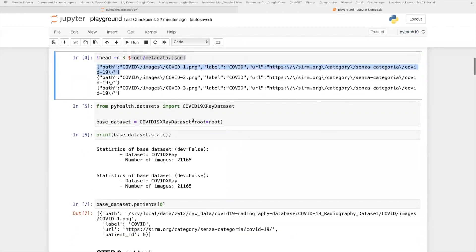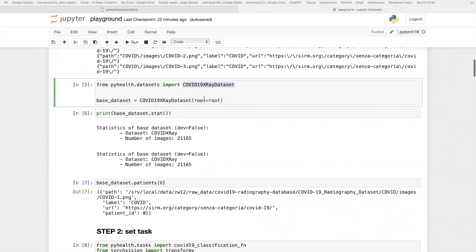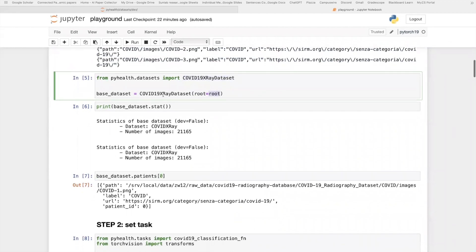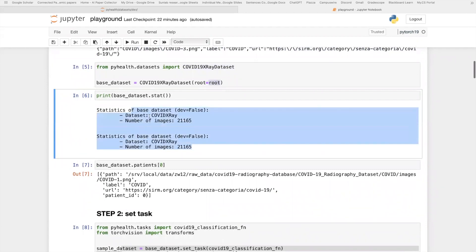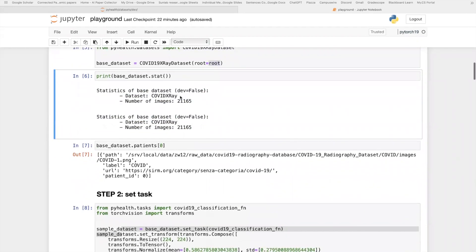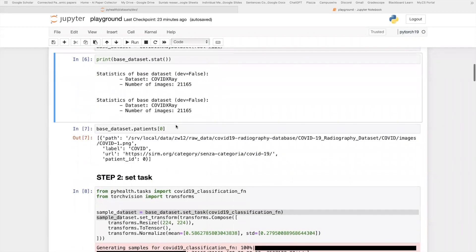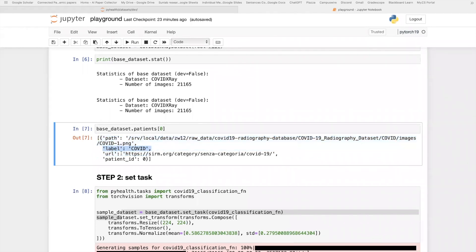What you need to do to load this data is essentially calling the corresponding image dataset, and then just tell the dataset where the root folder is. As you can see here, after loading the dataset, we can print out some statistics, such as the number of images. And here we can also see that each patient in this image essentially contains one x-ray image, and we also store the corresponding label and other meta information here. So that's how we load the metadata into this unified API.